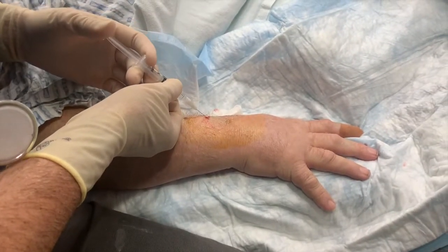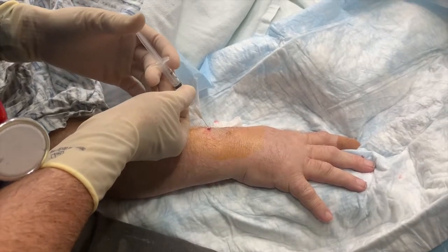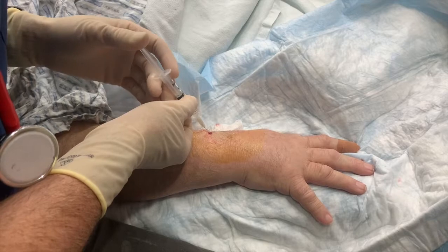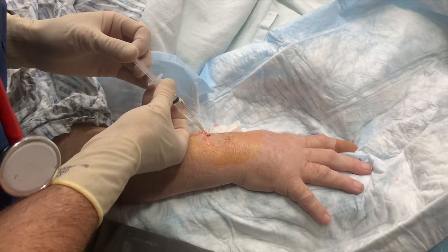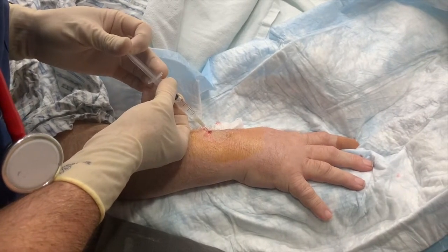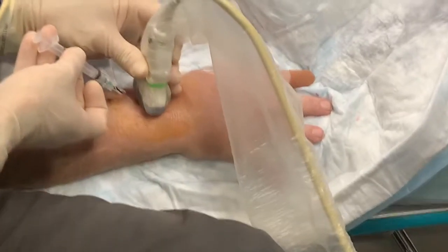Looks like a better angle. You're good. Okay, thank you.